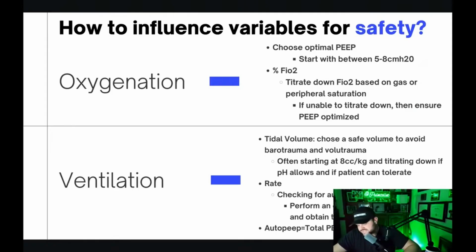remember, exhalation on the vent is passive if you're paralyzed. So you sort of inflate the lung and then the elastic properties get you back to FRC. So you take a breath in, and then from that potential energy that you store when you stretch all those muscles and tendons out, when you take that pressure away, everything sort of contracts back down, the air moves out. The problem is there's going to be some rate that's too fast, and that's going to cause auto PEEP if the patient's not participating in exhalation. So getting above 20 gets really difficult if you have sort of normal lungs.